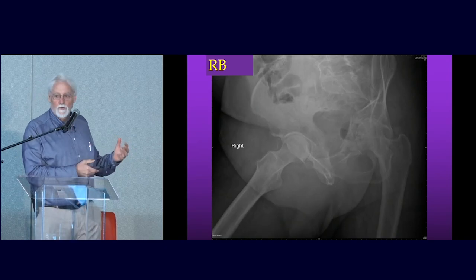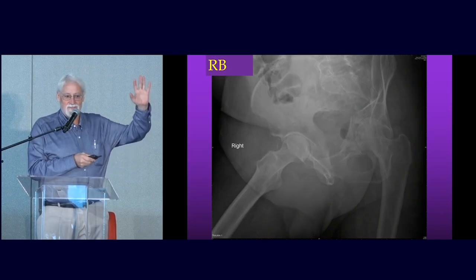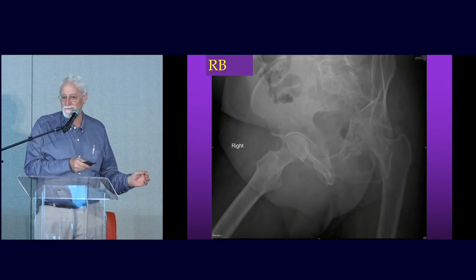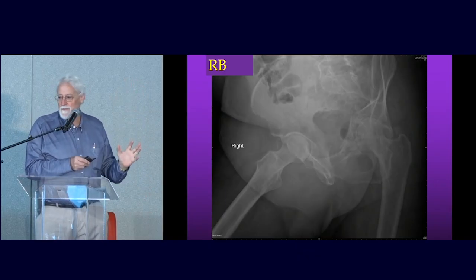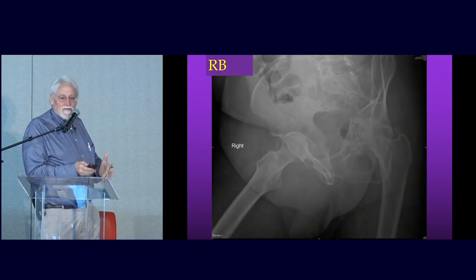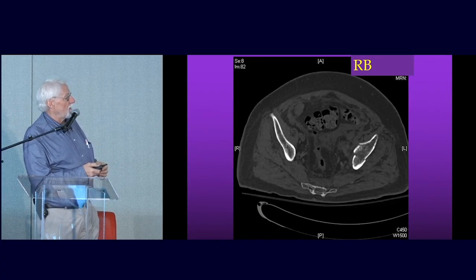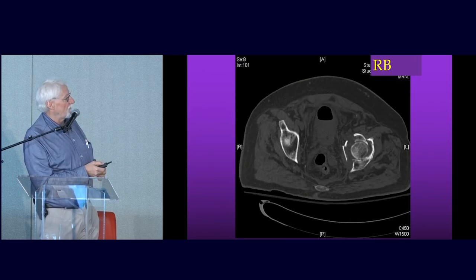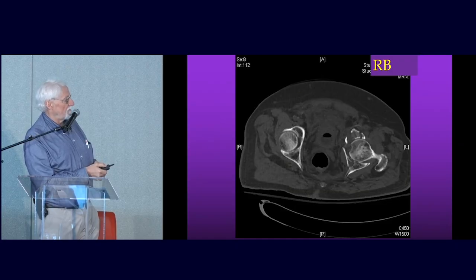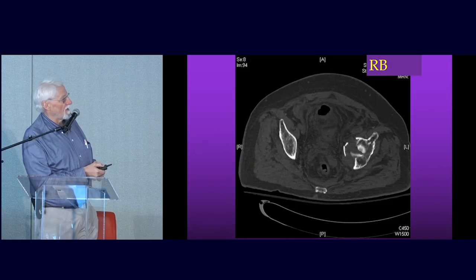All of this has a cortical piece with it. And so this is something that can be fixed, even though it's a 71-year-old with tons of problems. It's not a dome impaction, it's an impaction of the same part of the dome, but it's with the cortical piece, so you can reduce it. And here it is, and you can kind of see it's this piece here that I'm worried about, but it has a nice cortical piece to it. And so kind of a similar type of thing.